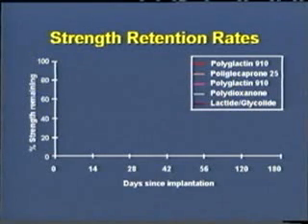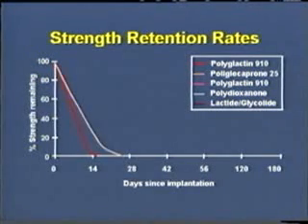Just as there are many factors to be considered in relation to the healing wound, there are many factors in the performance of absorbable sutures and their resulting contribution to successful wound healing. There are two aspects to consider: actual suture strength and how long is strength maintained. Suture strength is usually determined by its knot tensile strength, which is measured by the force which the suture strand can withstand at the point of knotting.